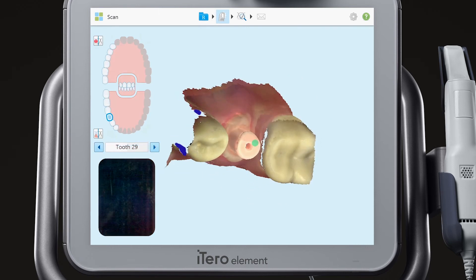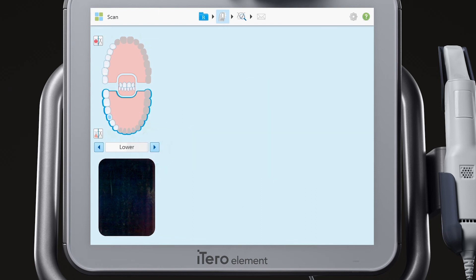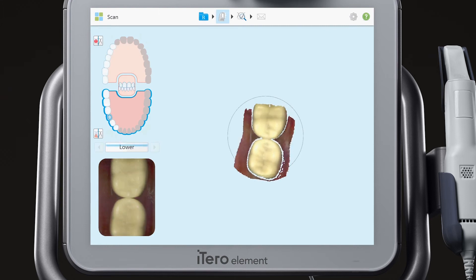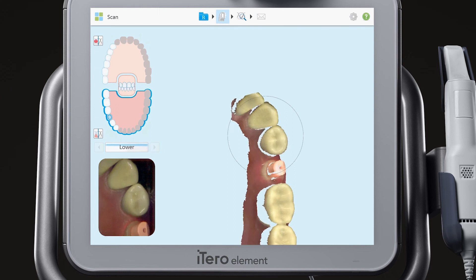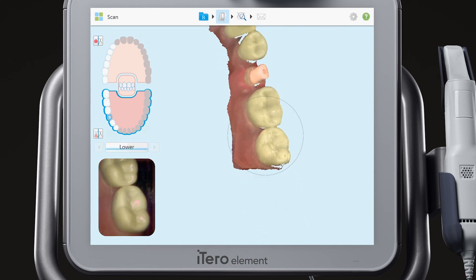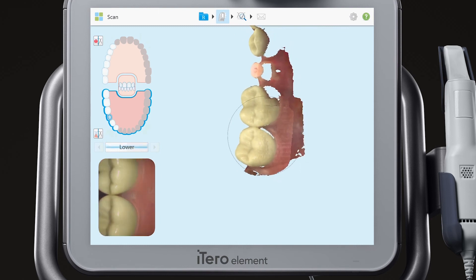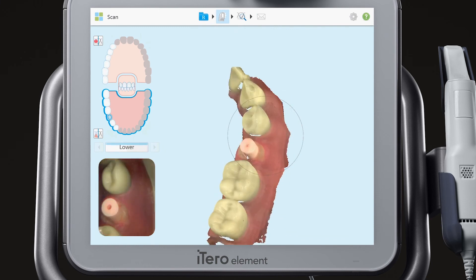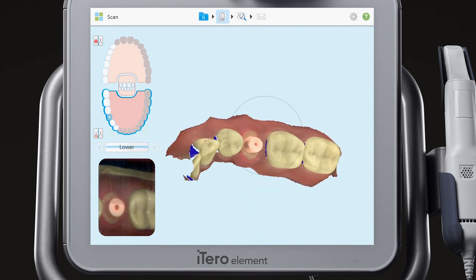Use the arrows next to the segment indicator box to move to the next segment, the scan body arch segment. Scan the occlusal, lingual, and contacts of the scan body arch.